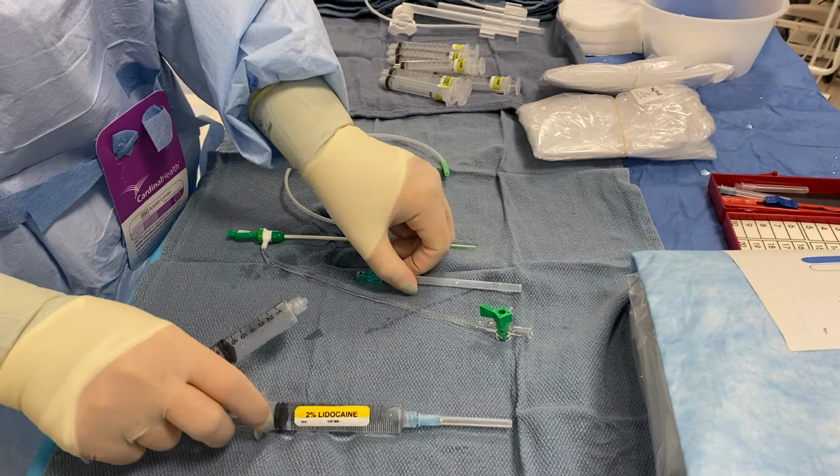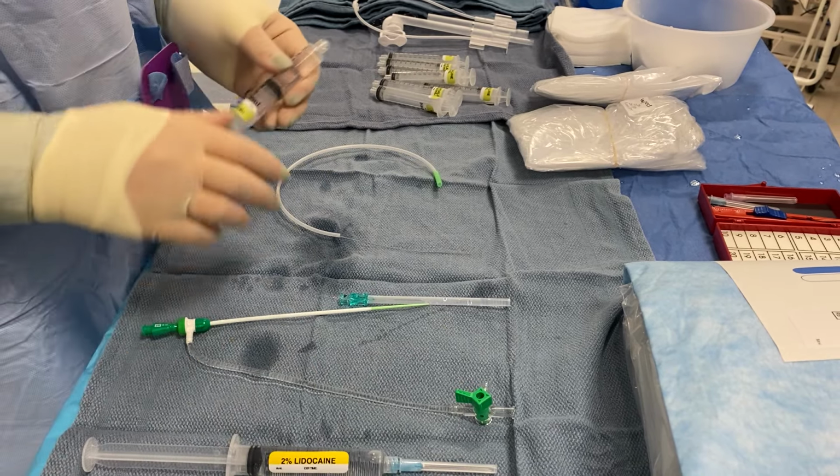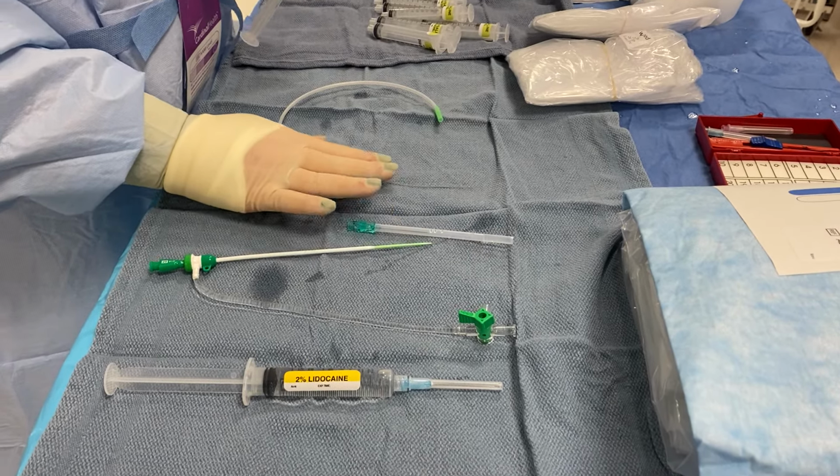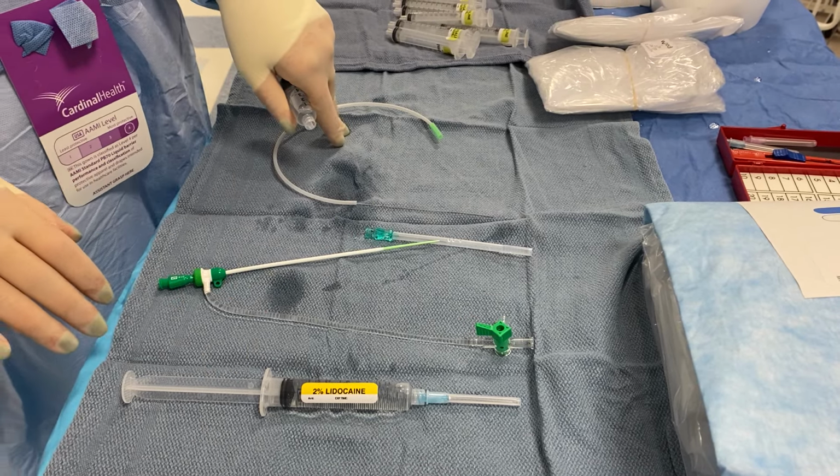So then, everything that we need for the first step of access, which is the lidocaine, the needle, the wire, and the sheath, I have all laying right here because this is right where the doctor is gonna stand when he gets access.